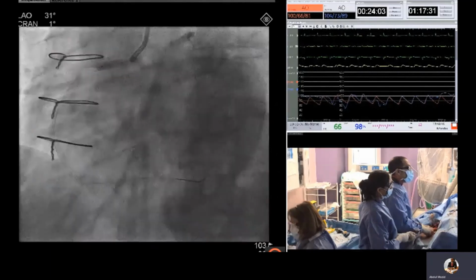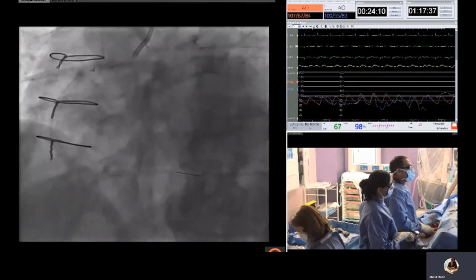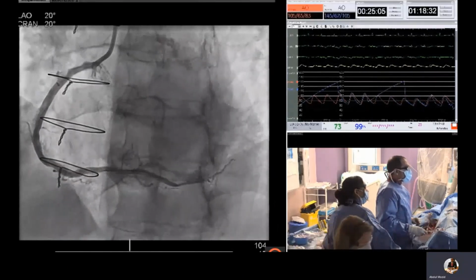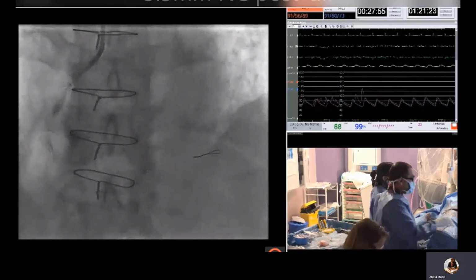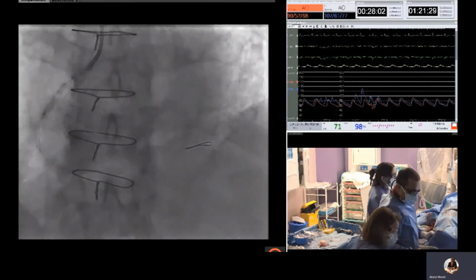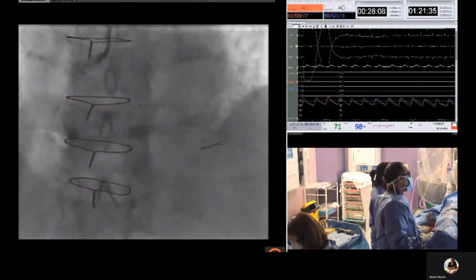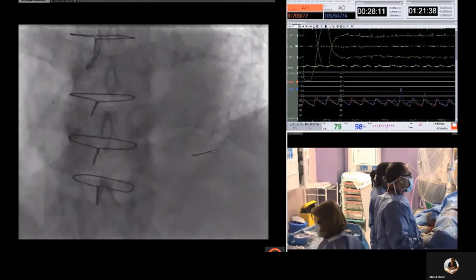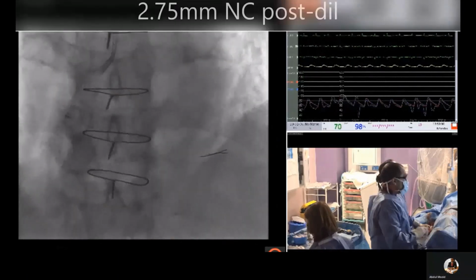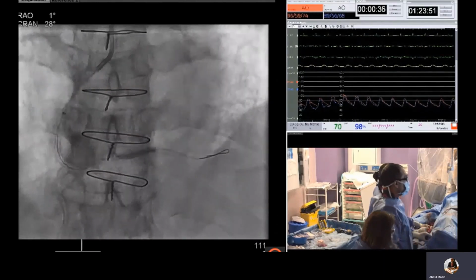The ostium was flared, and the guide extension catheter was redelivered. And this is the first angiogram following this, showing a patent vessel. Then we performed 3.5 and 4 mm post dilations from the distal to ostial RCA, and 2.75 mm high pressure post dilations distally in the PLV.